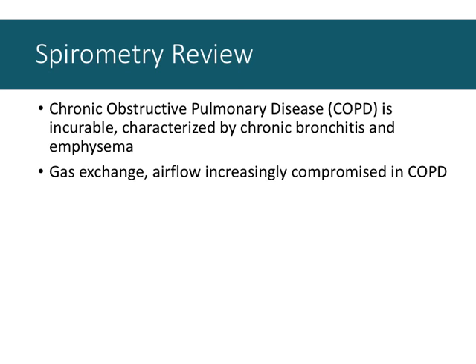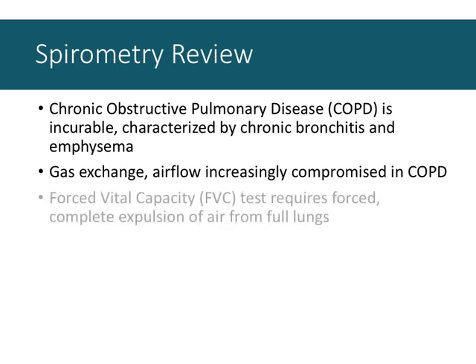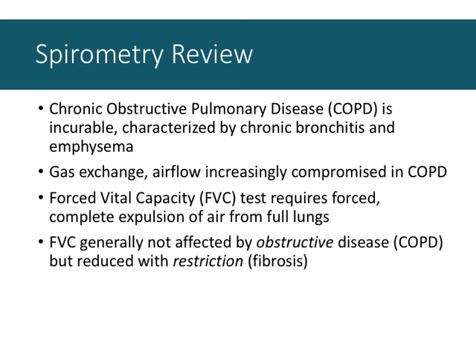We talked about diagnosing COPD or other respiratory diseases using the FVC test, the forced vital capacity test. It's not only a test of capacity, the forced aspect indicates that there's some testing of function, or there should be testing of function. So complete expulsion of air from the lungs, from full lungs to empty lungs, or as empty as we can go, as fast as we can go, is the forced vital capacity test. And I took you through a few examples of what the traces might look like in different scenarios.